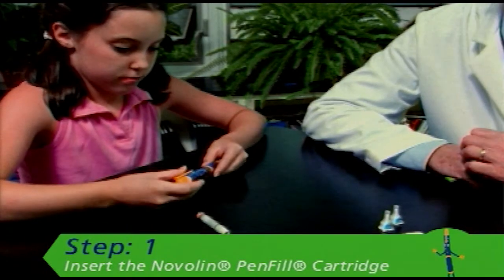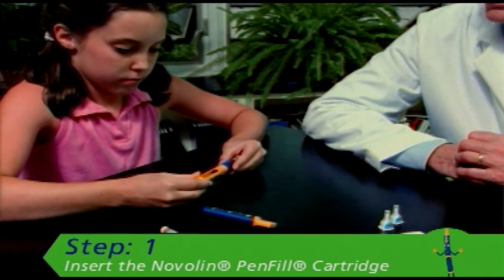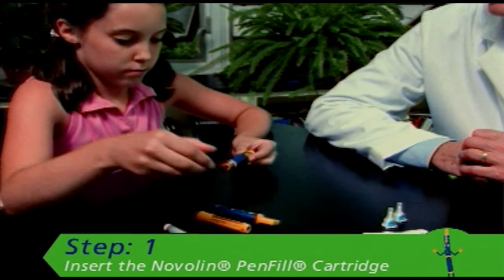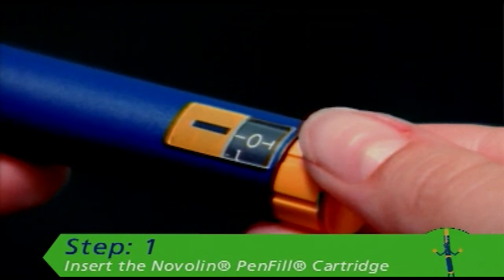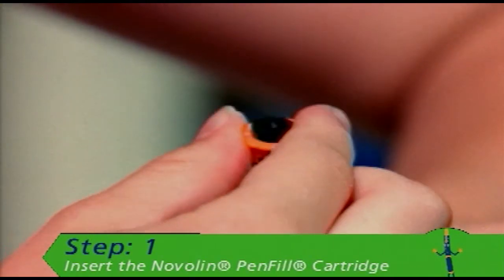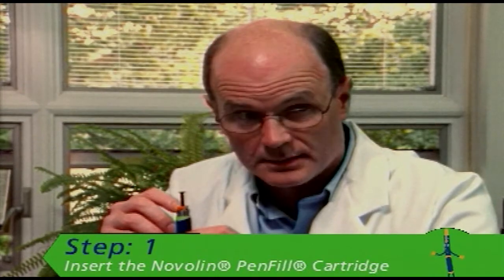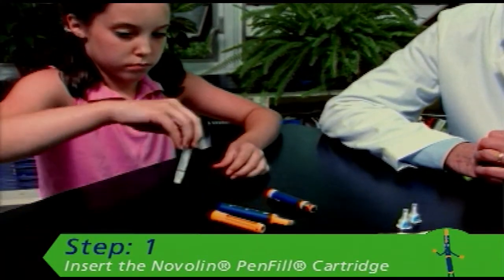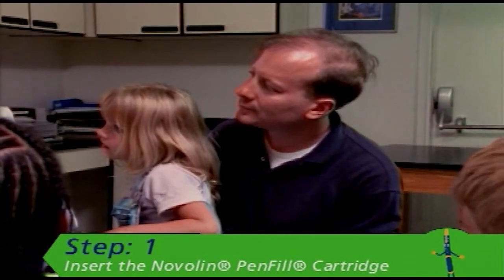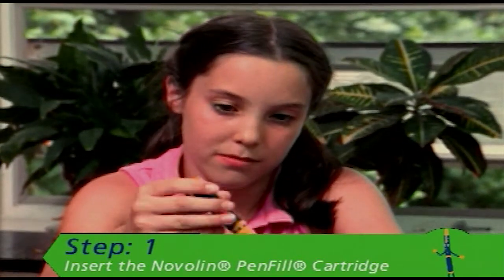Once you've done that, gently twist the pen cap and pull it straight up and off. Then unscrew and remove the cartridge holder. Make sure a zero appears in the dose indicator window. If the piston rod is sticking out, turn the reset mechanism to the right until the rod is flat against the end of the reset mechanism. Only do this when you're inserting a new cartridge — make sure you never push the piston rod back. If you're using an insulin that needs to be mixed, turn the pen-fill cartridge up and down 10 times until the insulin is white and cloudy. Then insert the insulin into the cartridge holder and screw the barrel onto the holder until tight.